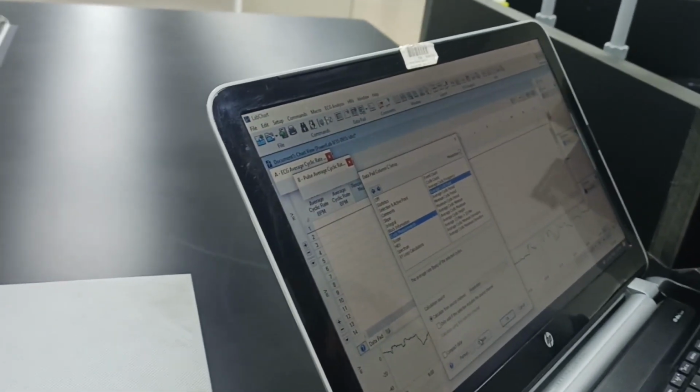Again, cyclic measurements, average cycle rate we see on the window, and in options we select respiratory belt. And in format we again go to fixed, no decimal required here. So we have got now 3 things.